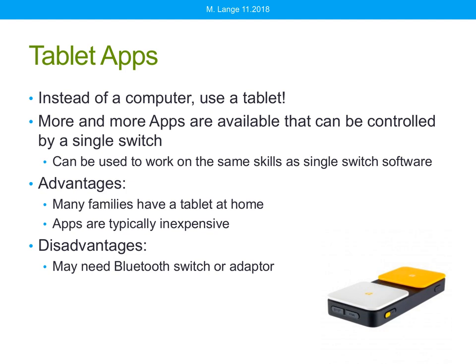We can now take advantage of many apps that can be controlled by a single switch and can be used to work on the same skills as single switch software. As we know, when tablets first came out, we really didn't have as wide a variety of apps available to us, let alone apps that were accessible and worked on such a specific skill.